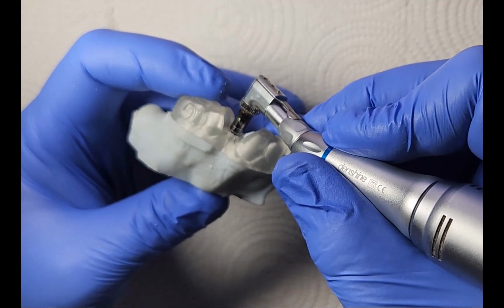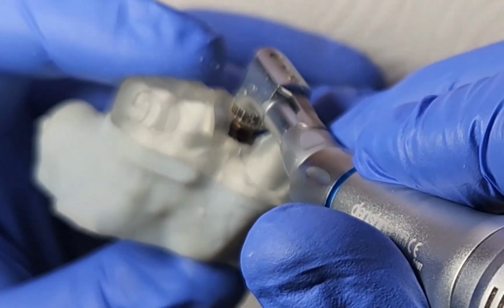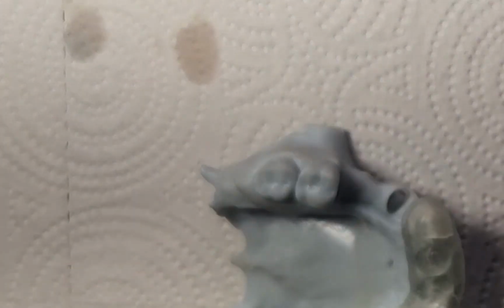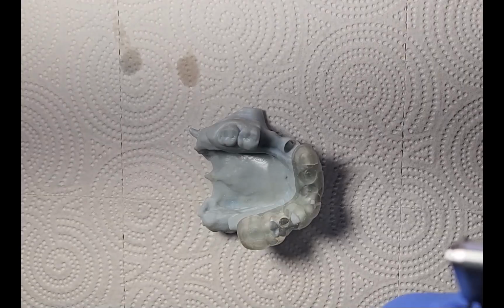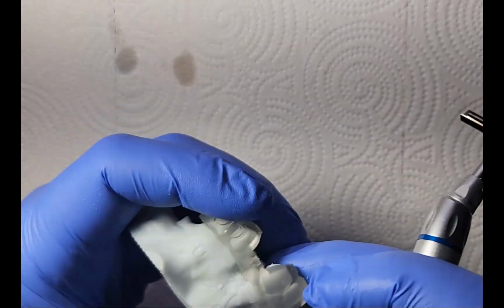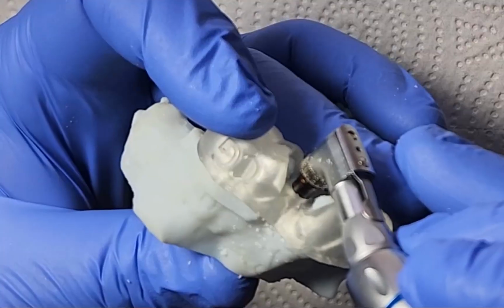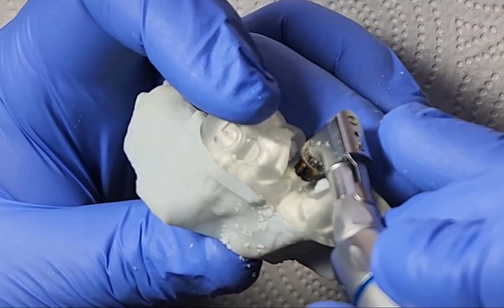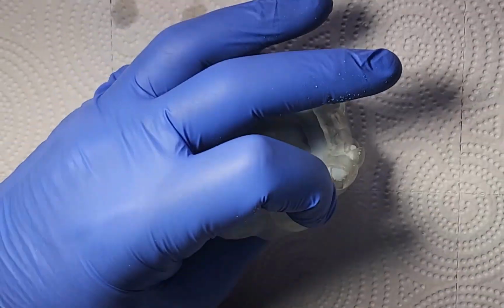Now, if you ever do run into the scenario where it looks like you should be bottomed out and yet your drill stop is not seating, that would be an indication that yes, you do probably need to use that profiler. So I'm actually going to go back and do that. I didn't think I would need to, but it's never a bad idea to just use this automatically. The only time I generally won't use this is when it's an immediate or an anterior and I'm not wanting to profile out a significant amount of bone right at the crest.